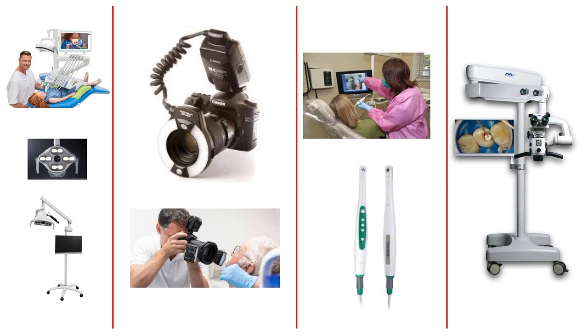The second way is the professional camera. This tool is very nice for taking high quality images, but it's not suitable for video recording inside the patient's mouth. The other way is the intraoral camera, which is a simple tool and not expensive. They also update this tool, and it is able to take still images and video clips, but in low quality. So it is suitable just for diagnostic purposes and to motivate the patient. So there is a difference between all these ways in the benefit of them, or in the quality of their images and videos.